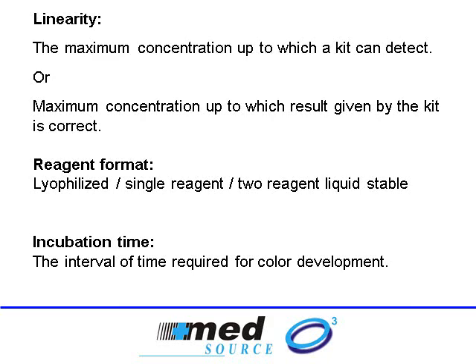The second factor that we have to look at, which is even more important, is what is the kit format? Are the reagents lyophilized or powder form, or are the reagents available in a single reagent, or are they available in two reagents? Briefly explained, lyophilized means powder form. In this case, the kit contains no liquid but only a powder in a vial. The lab should add a fixed amount of water, mix the powder in the water to make a reagent, and then finish the reagent within a certain number of days or weeks.